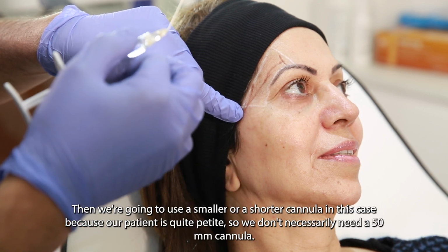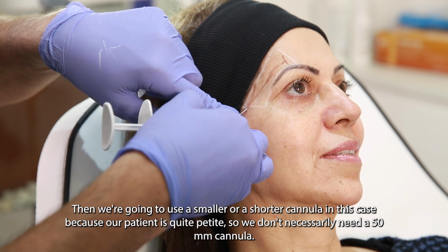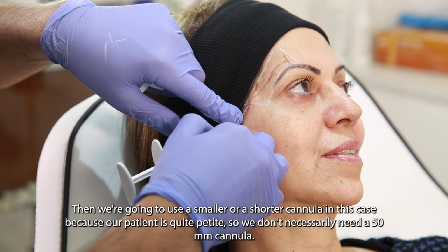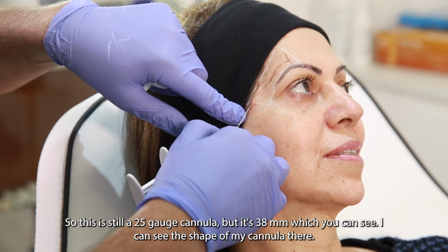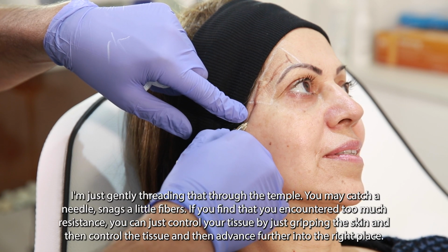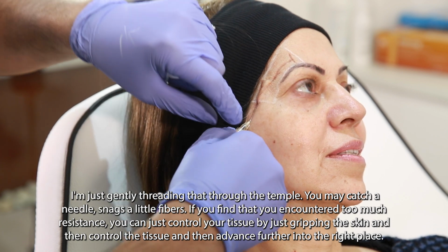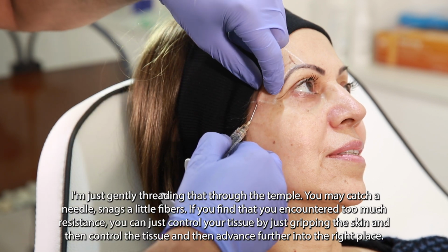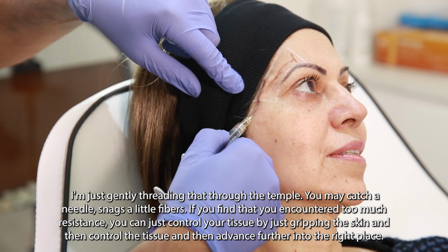Now we're going to use a shorter cannula in this case because our patient is quite petite. So we don't necessarily need a 50 millimeter cannula. So this is still a 25 gauge cannula, but it's 38 millimeters. So as you can see, I can see the shape of my cannula there. And I'm just gently threading that through, up through the temple. You may catch any little snags, any little fibers. If you find that you encounter too much resistance, you can just control your tissue by just gripping the skin and then control the tissue and then advance further. And now you're into the right plane.